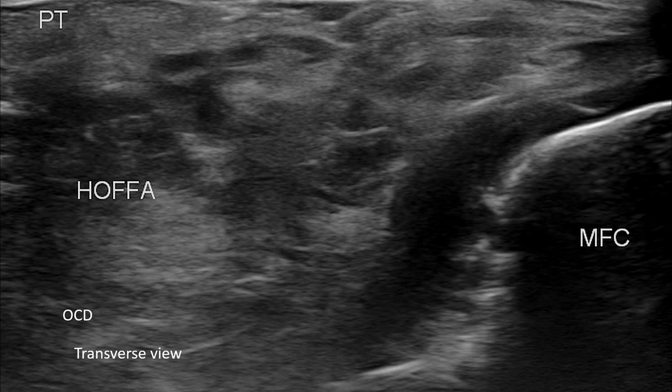The purpose of this presentation was to demonstrate selected articular cartilage pathologies as they may appear in knee ultrasound examination. Accurate assessment requires proper probe alignment, experience, and clinical correlation.